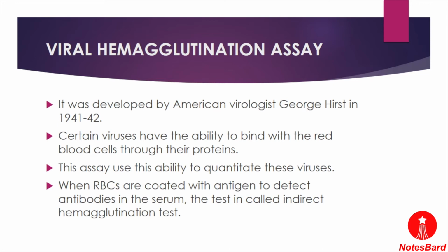So basically, when the RBCs are coated with antigen to detect the antibodies in the serum, the test is called the indirect hemagglutination test.